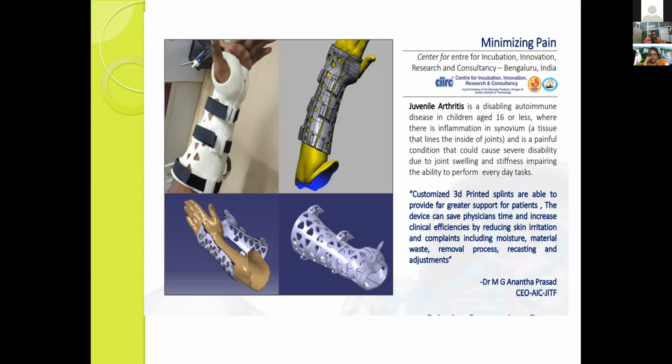In that case we directly take the data from the patient, but intraoral scanning is costly. The past practice, without scanning, was taking impressions and making the things. Maybe some expert person can directly see the design and make a replica without those things. So the basic thing is you are scanning something from the outer portions.